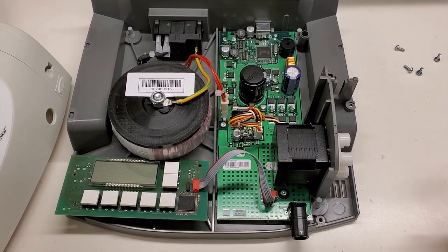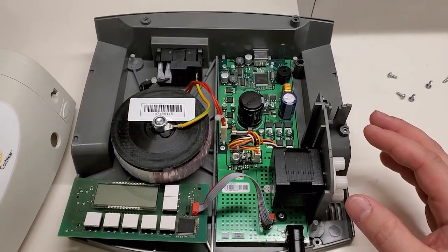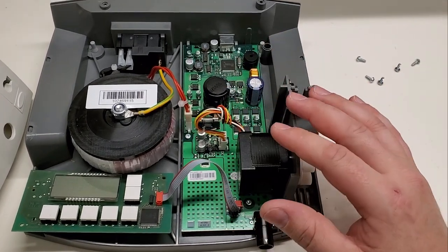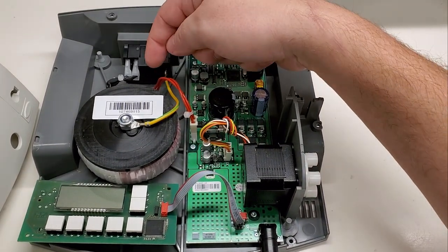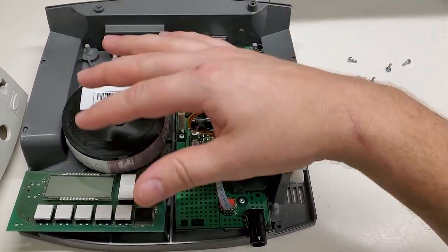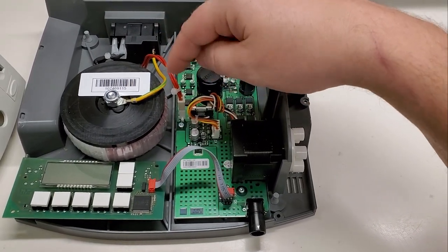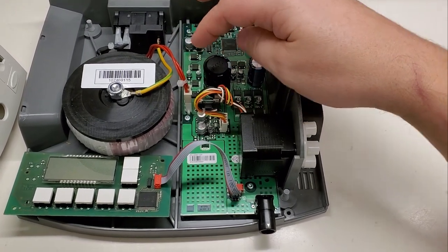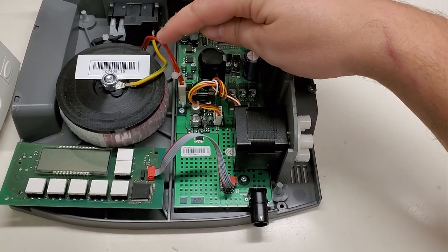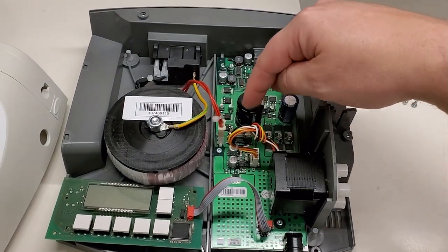First device that I'd like to go over, this one here is a cochlear implant driver, and you can see here I have a stepper motor. It's only got four wires coming out of it. I'll just go over what's going on inside here. You've got your AC that comes in, it goes into this toroid transformer, which either is just for isolation purposes or more likely it steps down the AC from 120 to probably, let's say, about 12 volts or 14 volts AC. Comes in here, you can see my rectifying diode, so it goes from AC to DC, and this big capacitor right here is evidence of your DC bus.